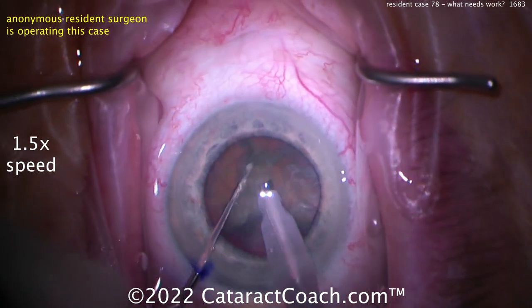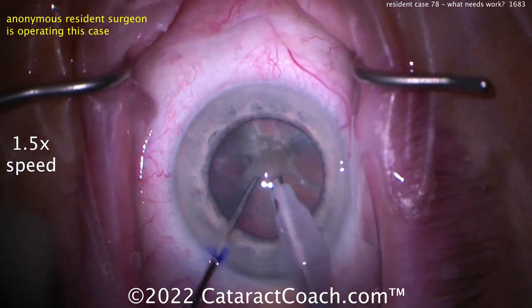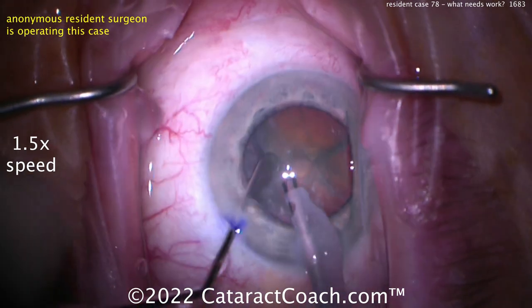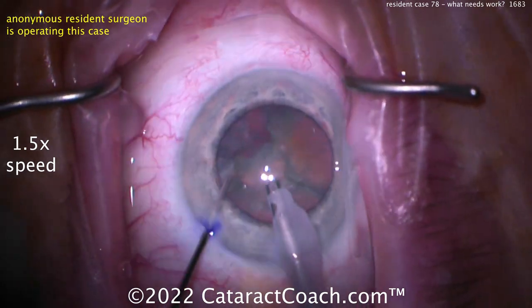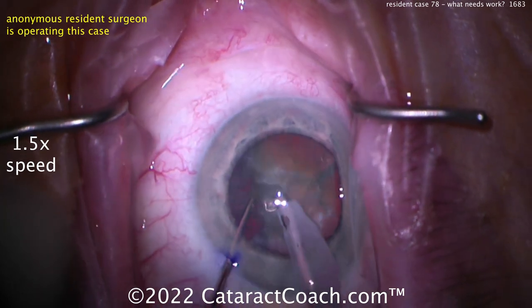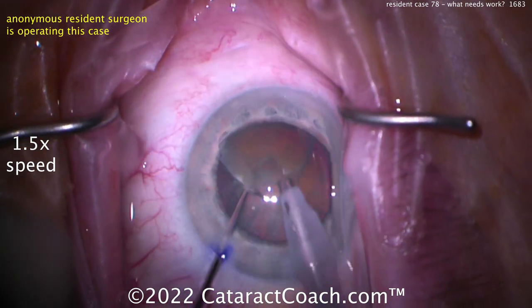There's going to be a shortage of ophthalmologists and cataract surgeons, so this is really fantastic — I'm glad you sent the video in. My number one pearl is actually to slow down. You're doing a great job, but savor every moment of the surgery and ask yourself at every step: how can I perfect this step? And you're doing a pretty good job already — I really have to give you credit.